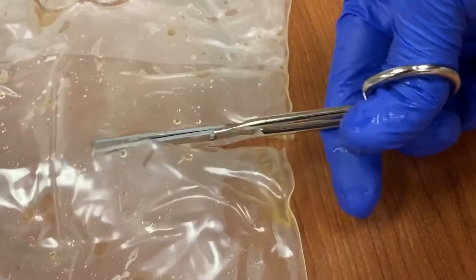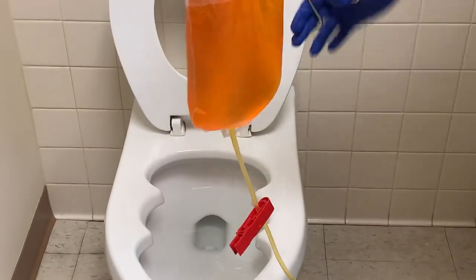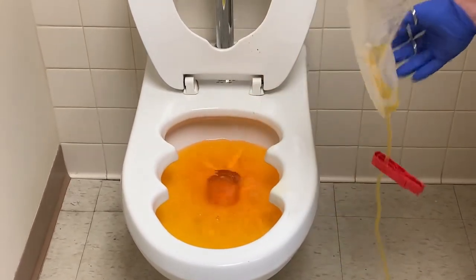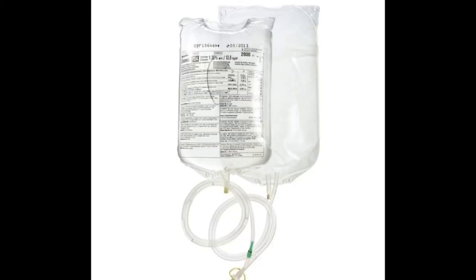We can now dispose of the fluid. Start by cutting an opening at the top of the drainage bag. Then go to your nearest toilet, dump the fluid in, and flush it. Be sure you save your ultra clamps, because these will be used for every transfer for this patient during their stay. This fluid transfer is now complete, but you'll still need to chart your data and results in Epic.